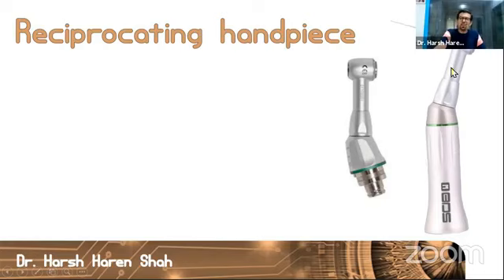What I am using is the one that goes on my micromotor. I don't use the one that goes on to the endomotor. Now, the advantage here when you use it on a micromotor is that you have a very large selection of speeds which is available. You don't need to be restricted to a particular speed because your micromotor can go up to a speed of about 30 or 35,000 RPM. So, which is why I am more comfortable using it on a micromotor.